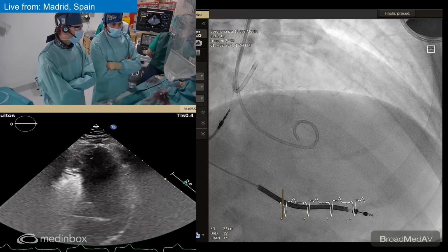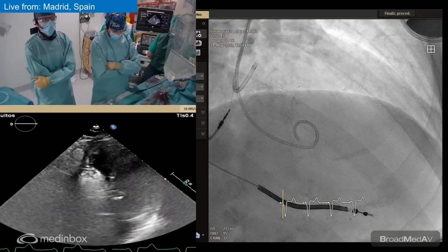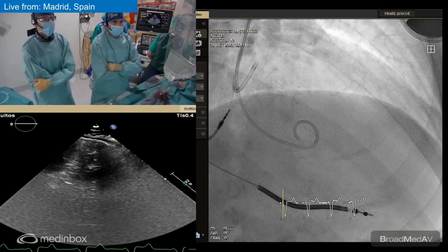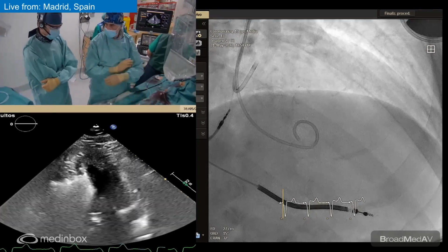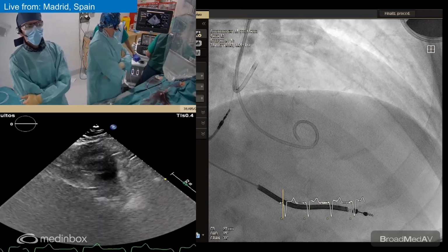I think we are not injecting more. No more. 32 there in this watch. 10 minutes more. I don't know if we'll have more time because it's 1 o'clock. We need 10 minutes or 15 to complete the case. We have injected near 5 cc's. Is that a large amount? Yes. We will give you a few more minutes. 2 more minutes.